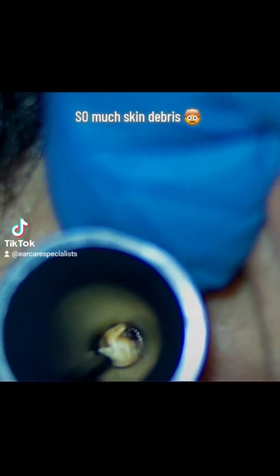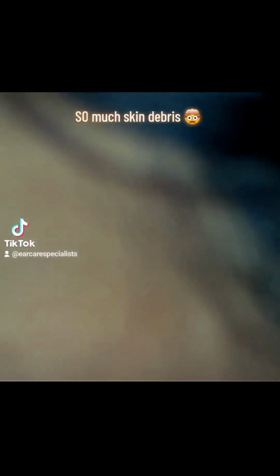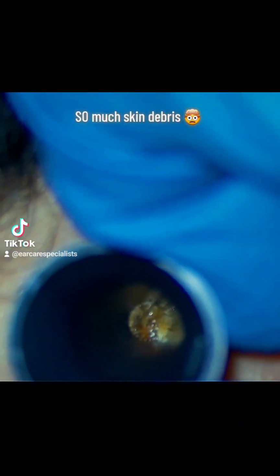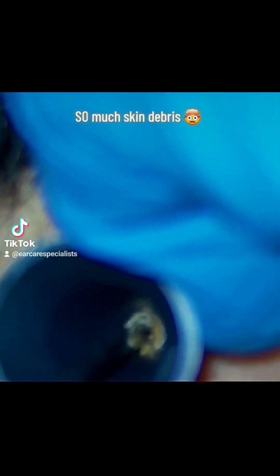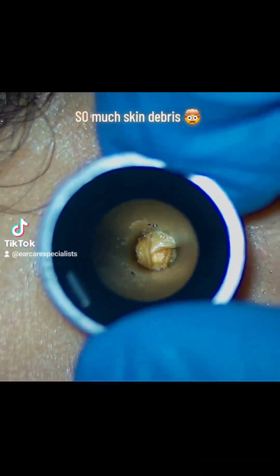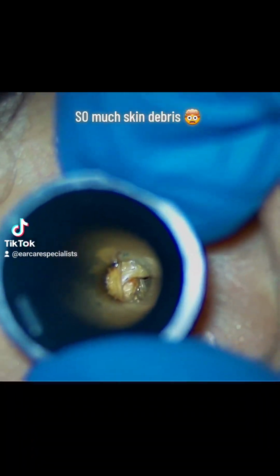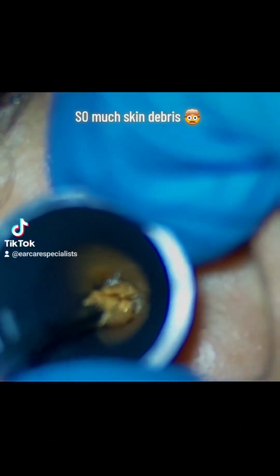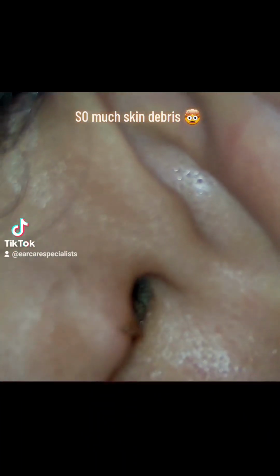You'll see there's so much skin debris in this ear, probably within the top 5% of patients that I've ever seen for skin debris removal. And the patient had originally been to their GP no less than 3 times for ear irrigation. Now just looking in the ear, irrigation is really not appropriate, blindly pumping water into the ear. I'm not a fan, as you know, but in this case it's not going to budge this. This is just impacted skin upon impacted skin.